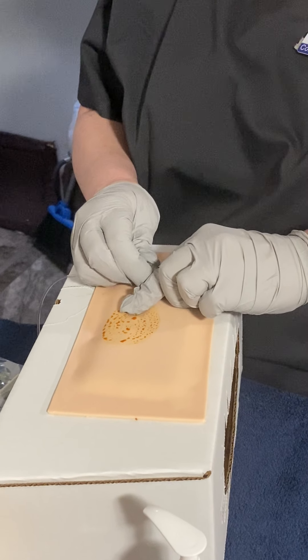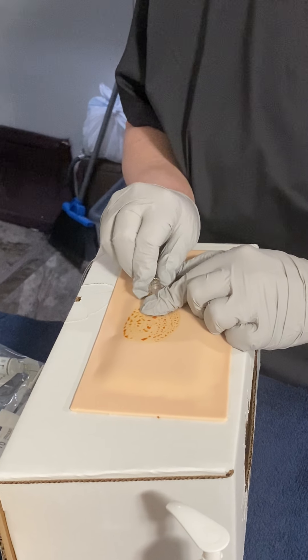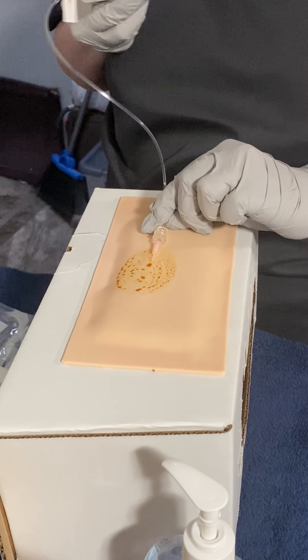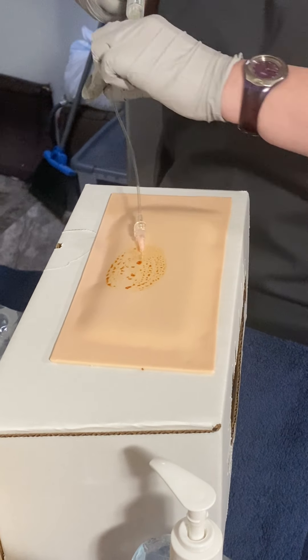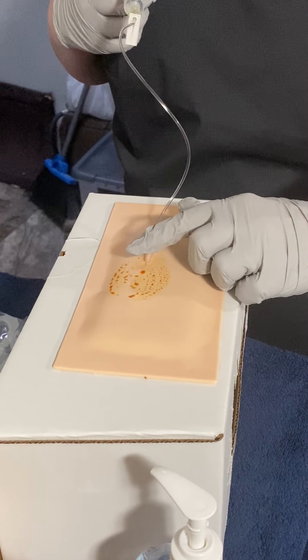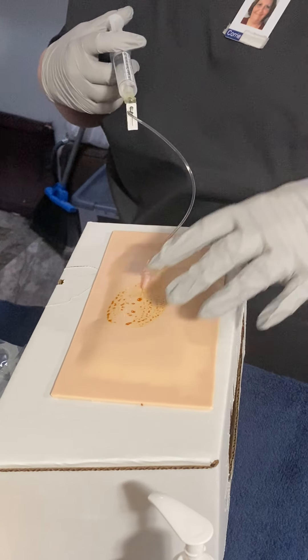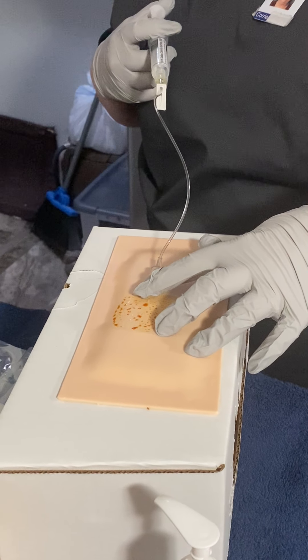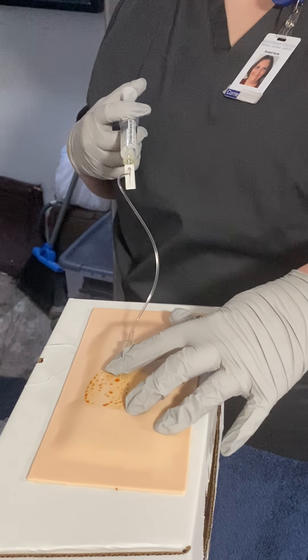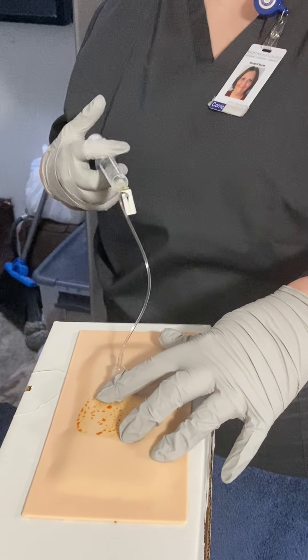Now I am going to connect my tubing. The first thing I'm going to do is remove this connector and put this in here and tighten it. Now I'm going to flush the IV to make sure that it's good. When I connected my flush I did make sure that the seal was locked, so now I'm going to make sure that it's unlocked. Please let me know if you feel anything when this is going in. Does that hurt? No. No burning or anything? Good. All I can do is taste it. Yeah, that is one of the side effects.